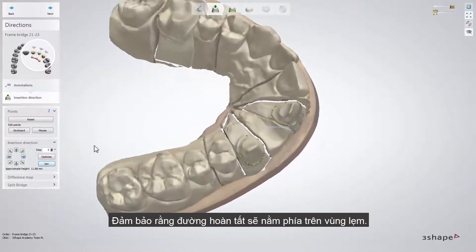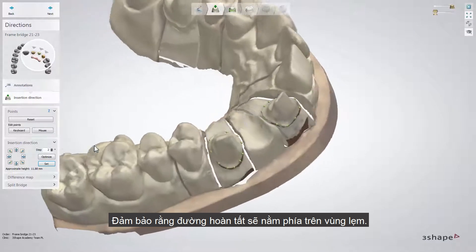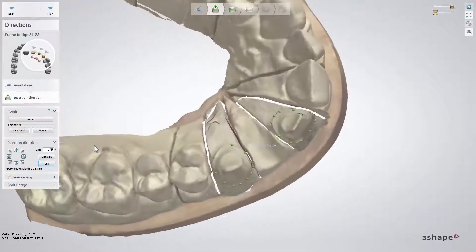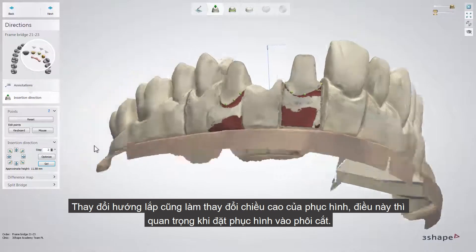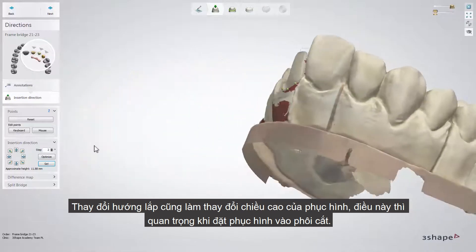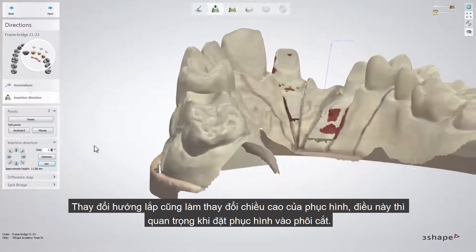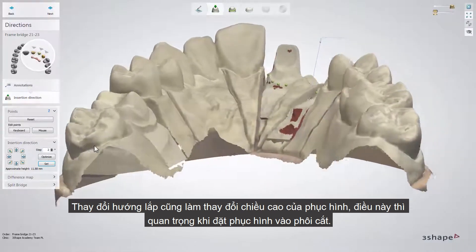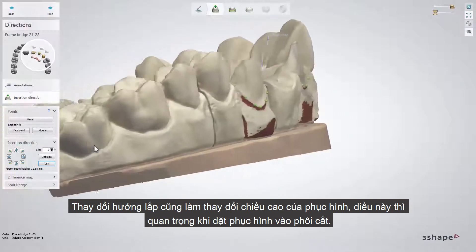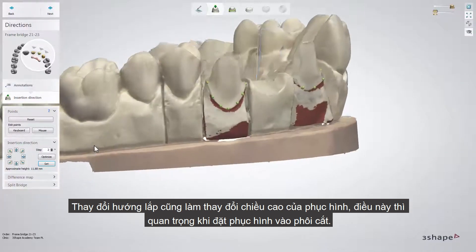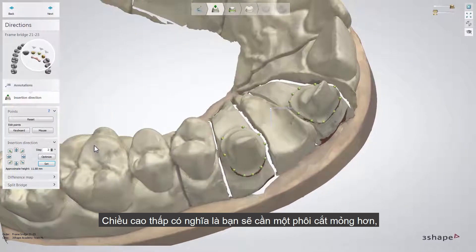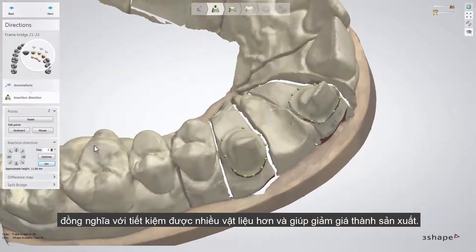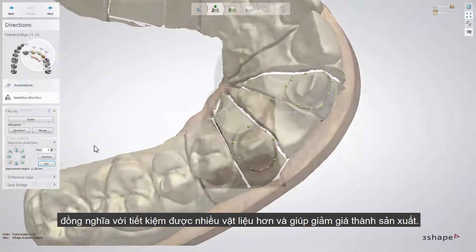Make sure that your margin line is outside of undercut areas. Adjusting the insertion direction gives you the opportunity to modify the height of the restoration, which is important when you place the restoration in milling blanks. Lower height means that you can use a thinner blank, which gives you the possibility to save materials and lower production costs.